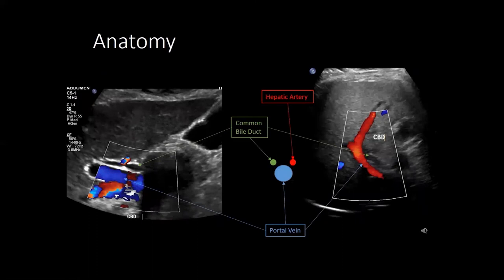It is important to identify the portal triad during this exam. As the largest entity in the portal triad, the portal vein is the easiest to identify. Note the echogenic walls of the portal vein, an important distinguishing feature of the portal vasculature. The common bile duct and proper hepatic artery run together with the main portal vein. Some call this the Mickey Mouse appearance, with the portal vein as the face and the hepatic artery and common bile duct as ears. See the included diagram.